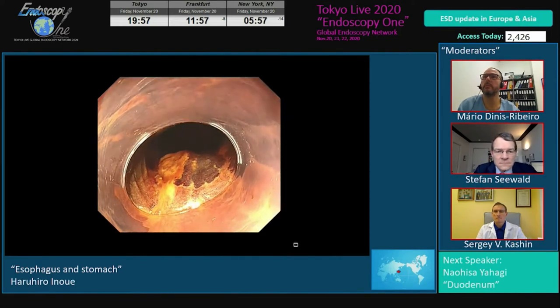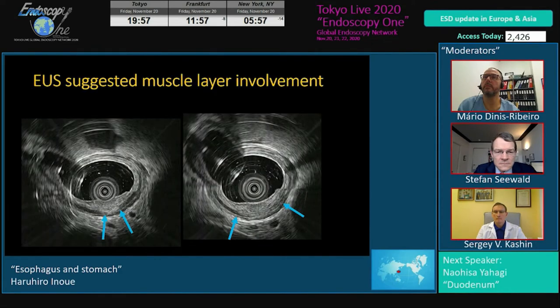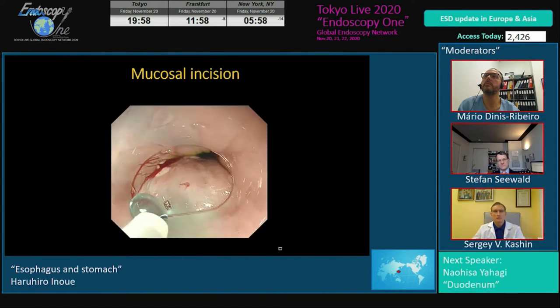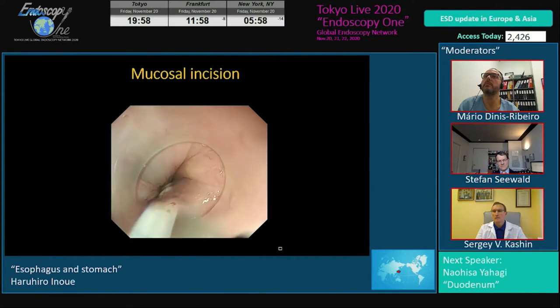So, iodine staining. Ultrasonography demonstrates, in between the two blue arrows, the tumor invaded the muscle layer directly. We can confirm it. In this case, of course, we checked beforehand. This patient has no lymph node swelling.